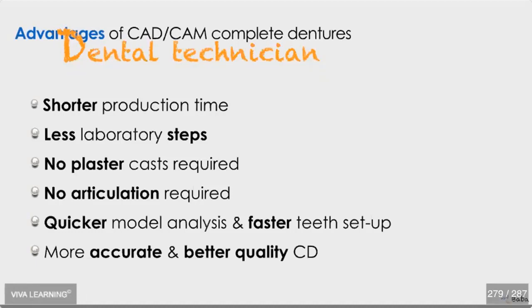For the dental technician, dentures take a shorter production time. They have fewer lab steps. There's no plaster, no articulation.